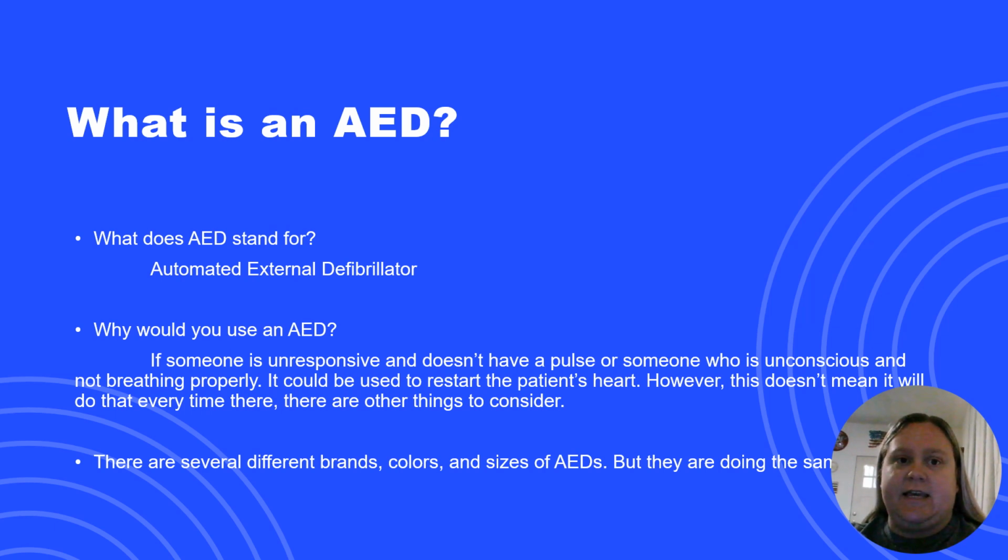As far as AEDs, it would be beneficial for you to look at your department's AED, or if you work in an office, your office's AED, because there are so many different brands, colors, and sizes of AEDs. They should all be labeled AED, but they all do the same thing.